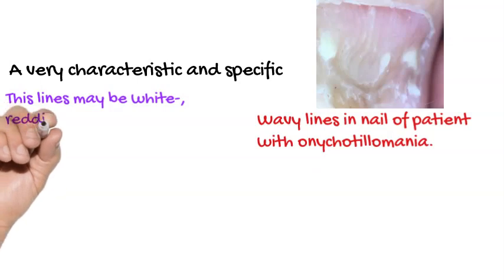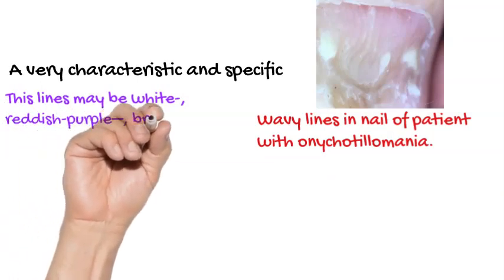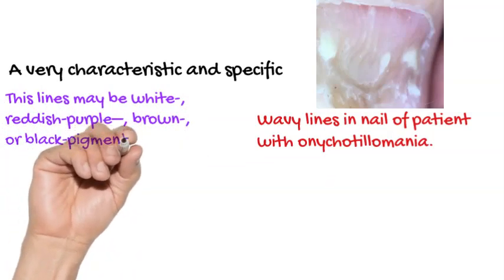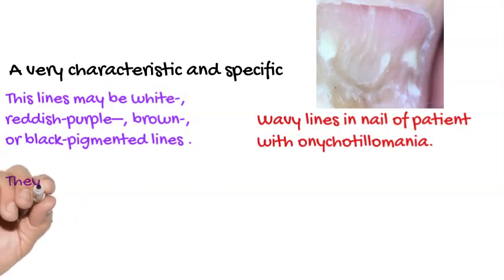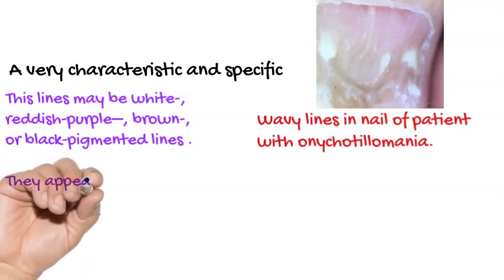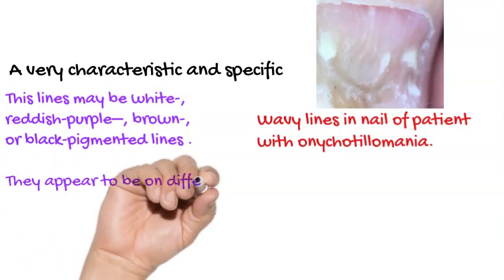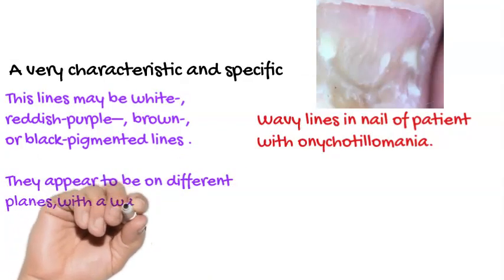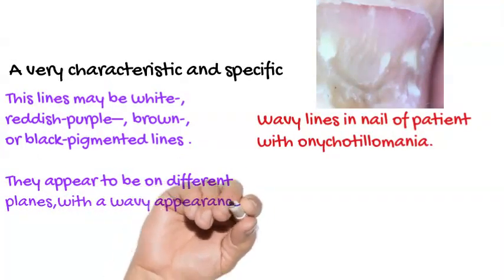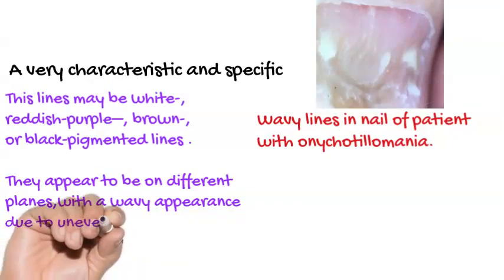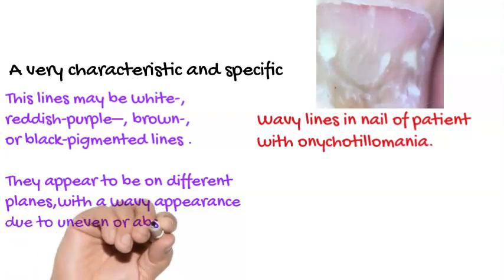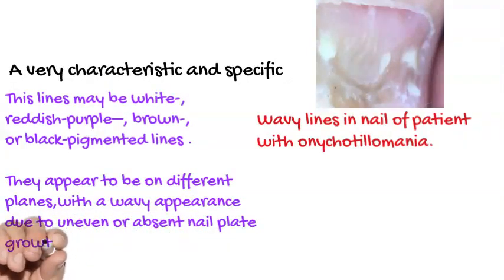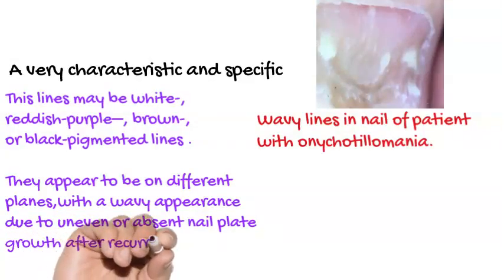These lines may be white, reddish, purple, brown, or black pigmented lines. They appear to be on different planes with a wavy appearance. This is due to uneven or absent nail plate growth after recurrent trauma.